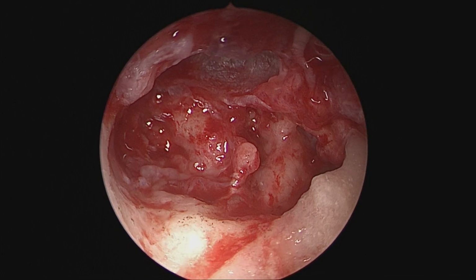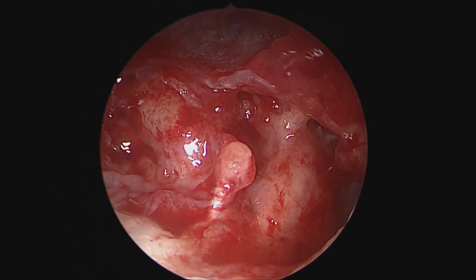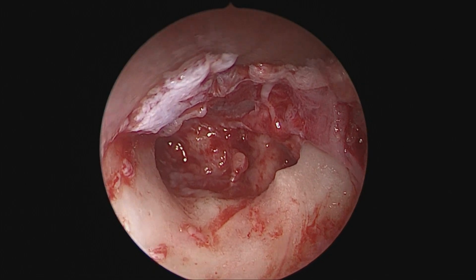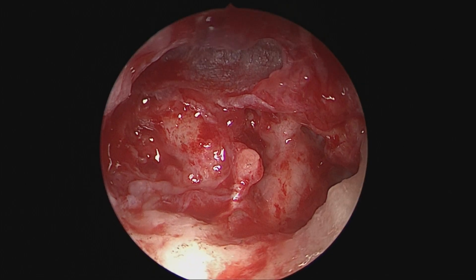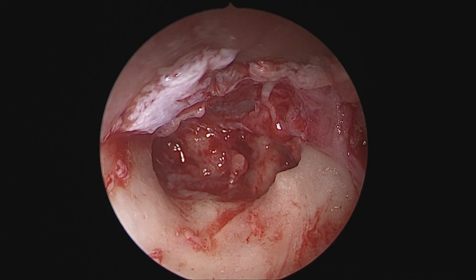And now post the same, you can see that the medial attic looks quite okay. The fallopian canal is in front, so is the processus cochleariformis. The malleus is still there. And now it comes down to the grafting.